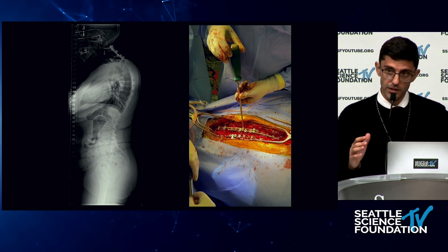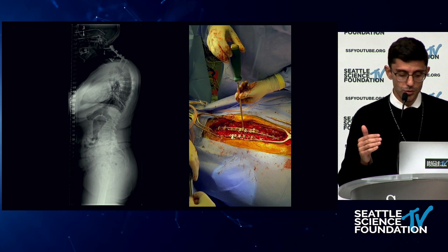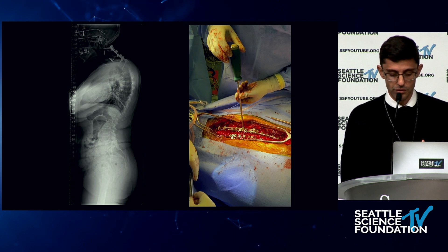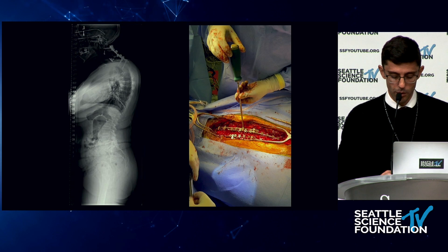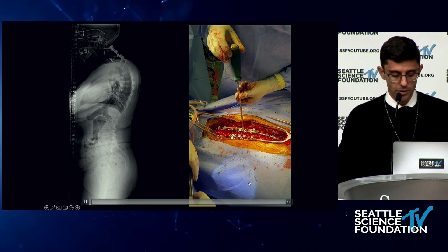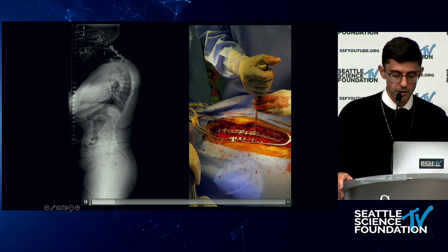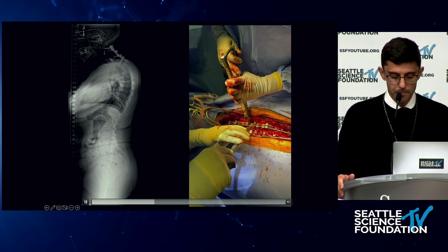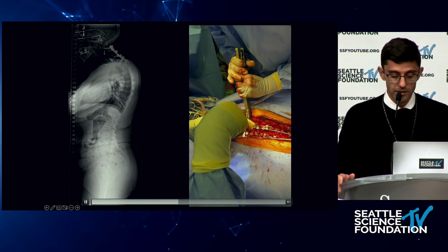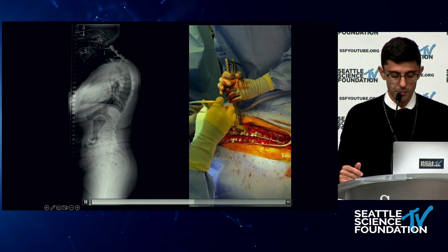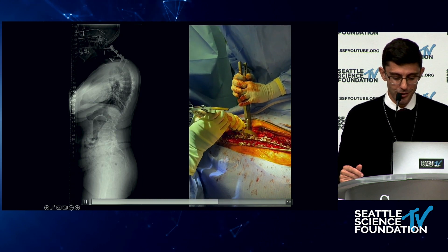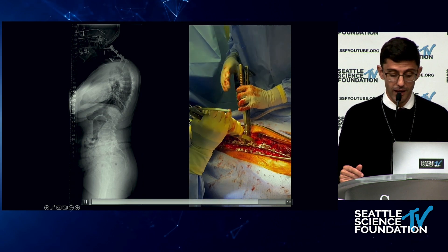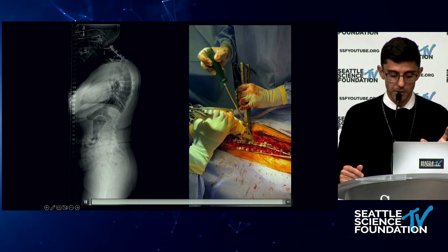The nice thing about this is we didn't have to take out all the old instrumentation. We simply cut the rod between T1 and T2, took out the T2 screw, placed new screws distally, and used the rail technique to perform our correction. With segmental compression, loosening those distal set screws with everything cranial locked, it's subtle but the correction is very powerful — the whole construct shortens through the three-column osteotomy site.